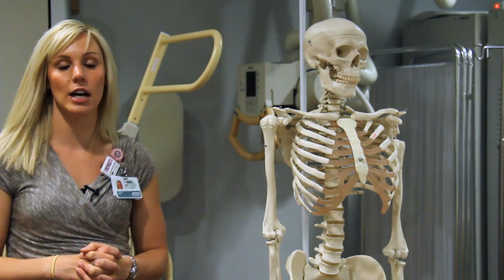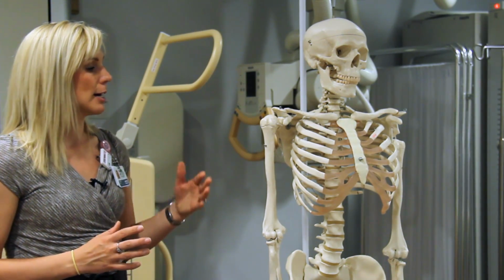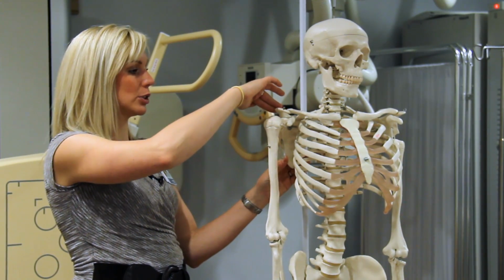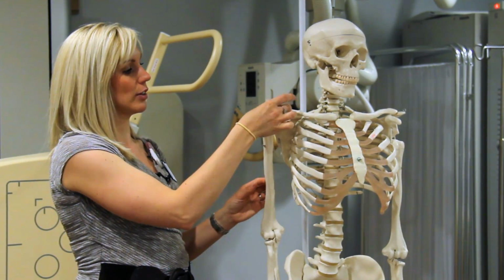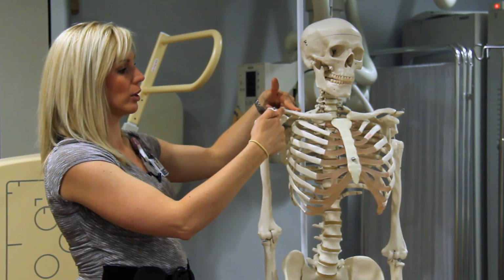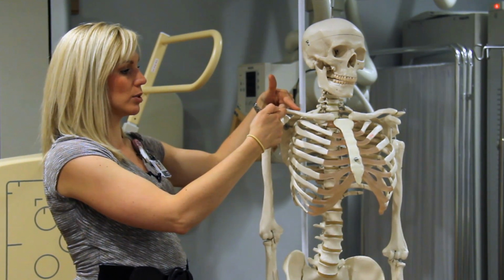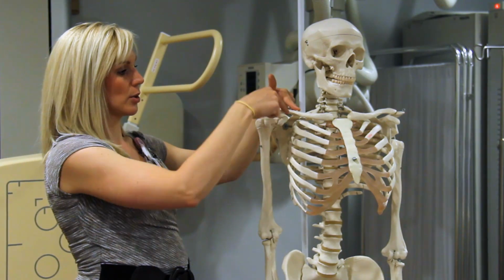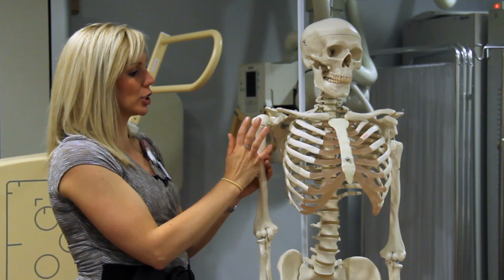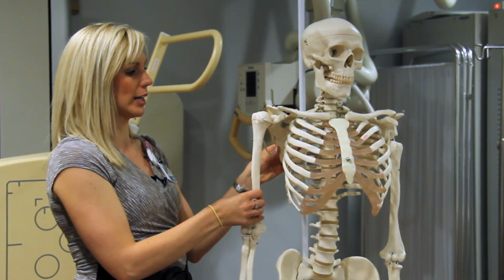The last thing is the landmarks. There are a few very important landmarks that we use for most of our shoulder imaging. The AC joint, which we can find by following the crest from the posterior aspect around. The AC joint you can feel on most every patient, as well as the superior angle. Those are going to be two of our main ones for getting true Y views, getting true Grashies. So AC joint and your superior angle, posterior aspect, as well as your greater and your lesser tubercles. Those are very important in our AP imaging with internal and external rotation.